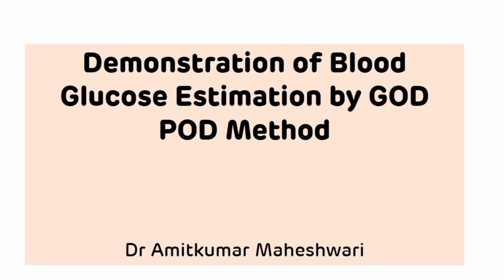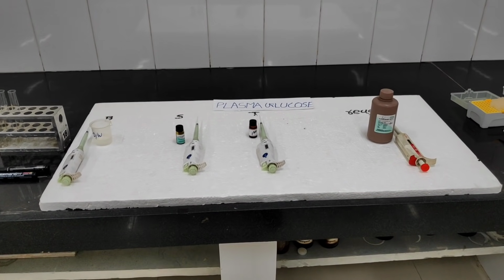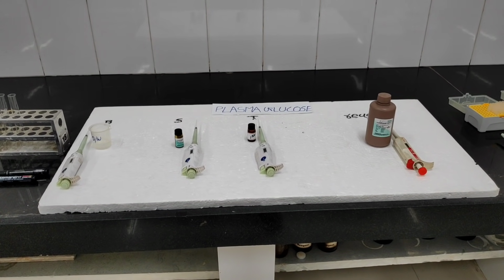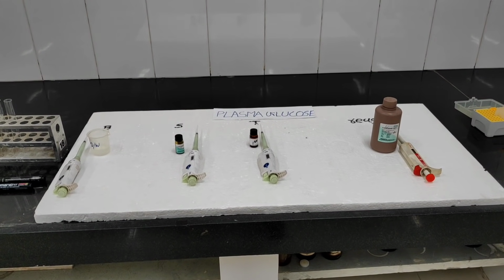Now, let's see the demonstration of blood glucose estimation by the glucose oxidase and peroxidase method. As we have already seen the theoretical part of estimation of plasma glucose, now we will see how to do the operational procedure for the plasma glucose.